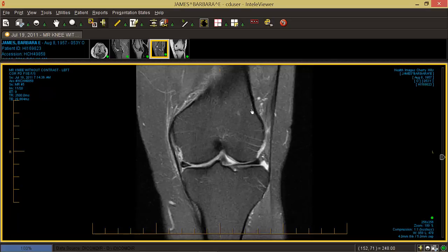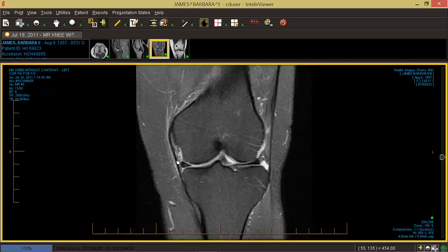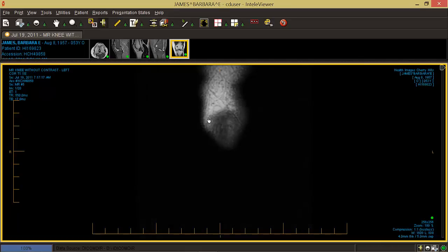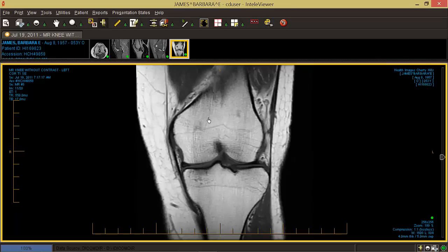What do we see here? Up top is the femur bone, on the bottom the tibia bone, and this dark triangle on the inside and this triangle on the outside are the meniscus — the shock absorbers. You can also see the darker color which is the bone, and then the lighter color which is the cartilage on the very end. There are two kinds of coronal images: this one where water is bright, also called a fat sat, and then one where the bone is light, the cartilage is dark, and the meniscus is about that same dark color.